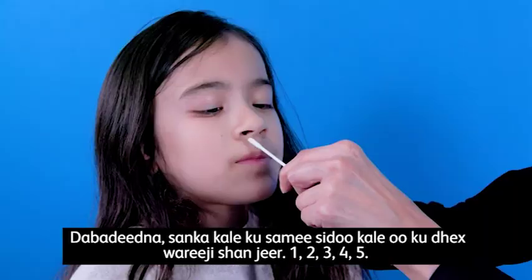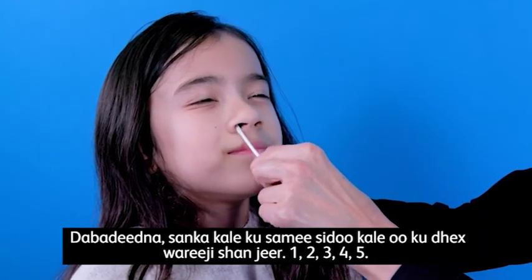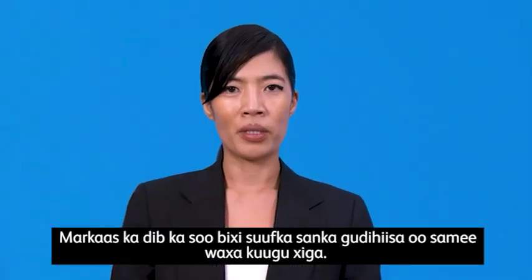Then switch to the other nostril and circle five times — one, two, three, four, five. You may now remove the swab from the participant's nose and move on to the next step.